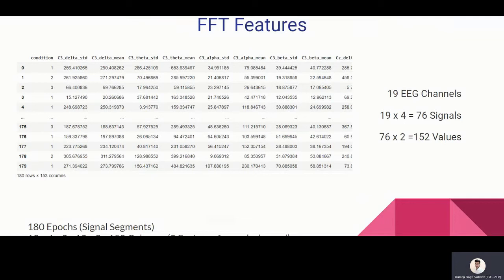So you can see these features I got for the C3 channel: C3 Delta standard deviation, C3 Delta mean, C3 Theta standard deviation, C3 Theta mean and so on. So you can see in the right side, we have 19 EEG signals and 19 into 4, we have four ranges of 76 signals and these 76 signals are then again divided into two mean and standard deviation values and we got around 152 values. And we have total 180 epochs.